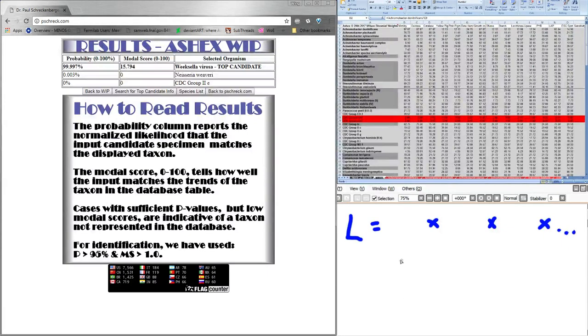And so let's say you have a 90% in your table, right, for a specific test, so 0.9. If you come in and you assign a positive value here, it's going to come to your likelihood for that specific bacteria and drop a 0.9 in this likelihood calculation. However, if you were to give it, say, a negative value, the number that it would put in here is actually 1 minus 0.9, and so you'd be left with 0.1. So of course, because this is different, this is discrepant with the expected result, your likelihood value drops.